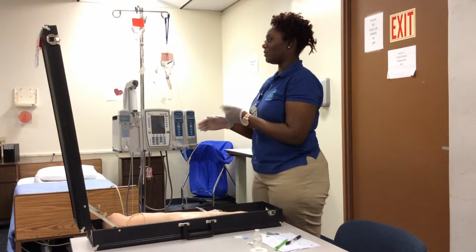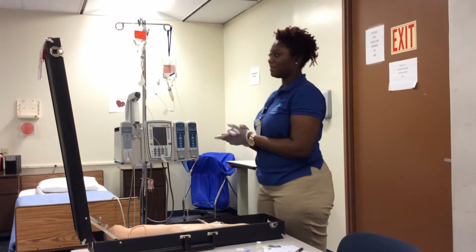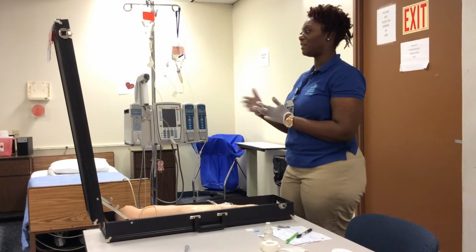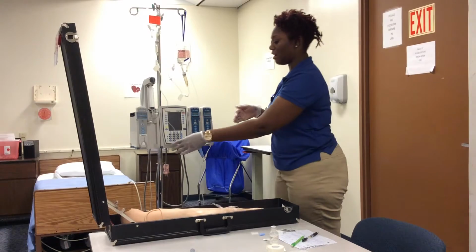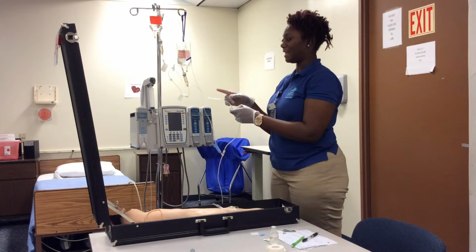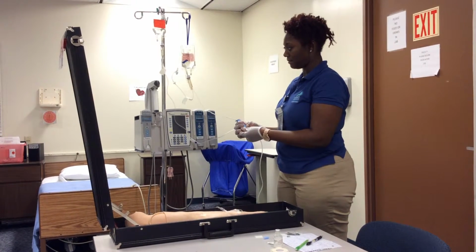Okay, good. So after I establish that, I'm going to check for any swelling, any pain or tenderness. Alright, so I'm going to remove my gloves and wash my hands. So now I've been observing the IV line for 30 minutes, and I'm going to come back into my patient's room. Next, I will wash my hands and place new gloves on, and I will shut off the secondary line. Good. Turn on the primary line.